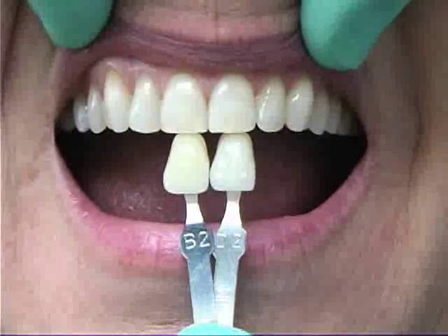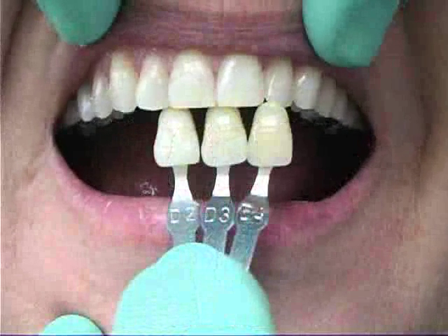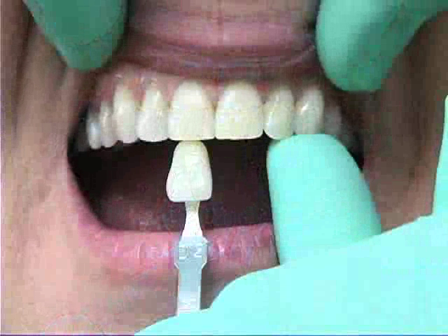For this patient, the D group was determined to be the best. Identification of the best D specimen is then made by simultaneously holding all the D samples next to the teeth. It is usually a relatively easy process to identify the number of the specimen that most closely matches the color intensity or chroma of the natural teeth, and D2 was determined to be the best choice.